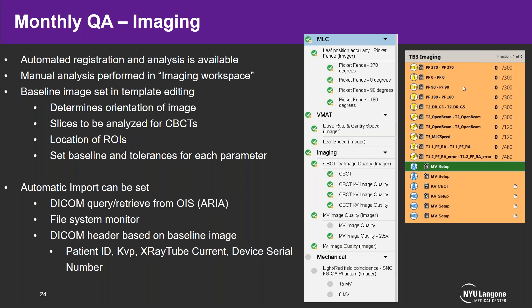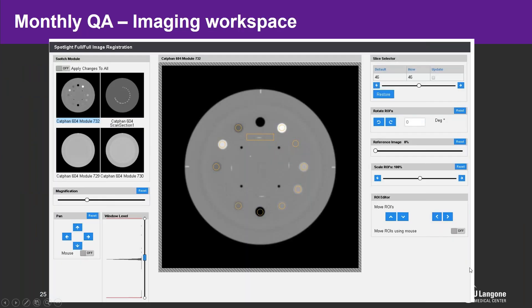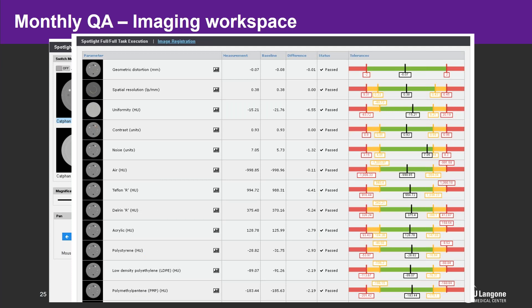Auto-match in SNC Machine is done based on DICOM header information for the baseline image, using the patient ID, image energy, image current, and device serial number. You can see our task list in SNC Machine covering all imaging sets including MLCs, picket fence tests, VMAT tests, and imaging tests. This is a look at the QA plan we load on the TrueBeams to run through everything.